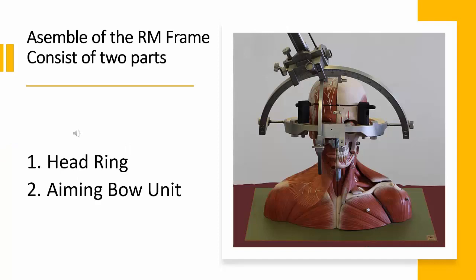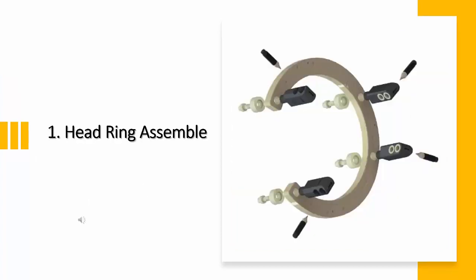Now let's start to assemble the RM frame. As mentioned, the RM stereotactic system basically consists of a headring and an aiming bow unit with instrument carrier. The assembly of the RM frame consists of two parts. Let's look at the first part: the assembly of the headring.